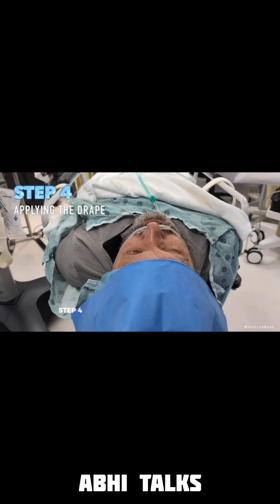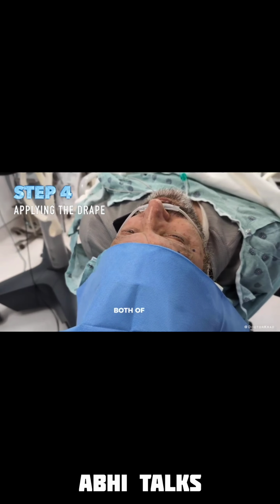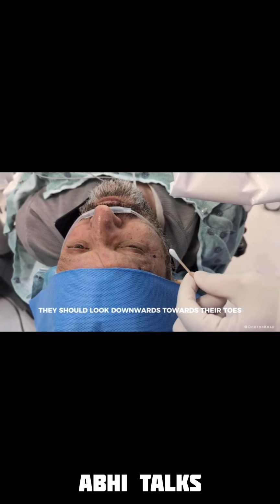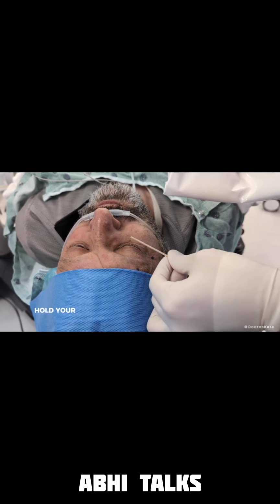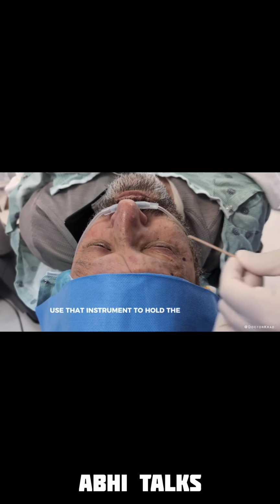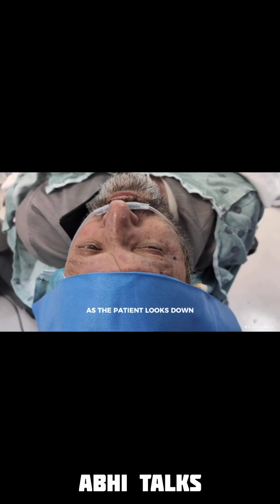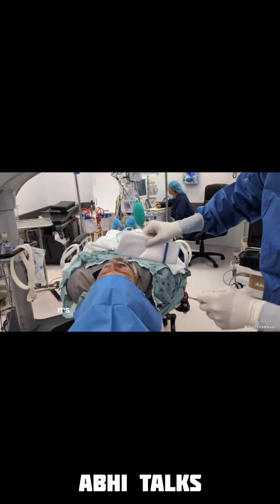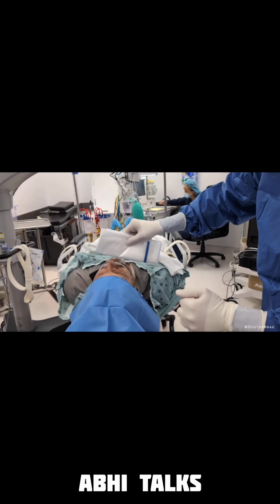Step 4. Ask the patient to open both eyes and, without moving their head, look downwards towards their toes. With the opposite hand, hold your sterile instrument, whether it's the cotton tip or Weck-Cel, and use it to hold the upper lid up as the patient looks down. Do not come down on the eye from above, as it will make the patient flinch. It's best to bring the drape from the side.